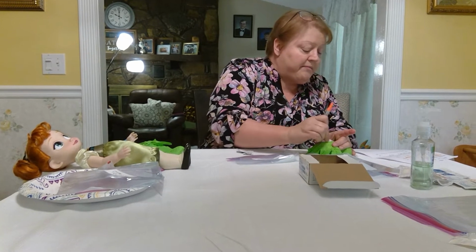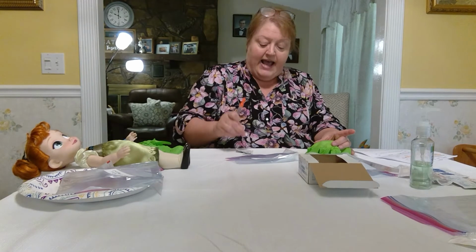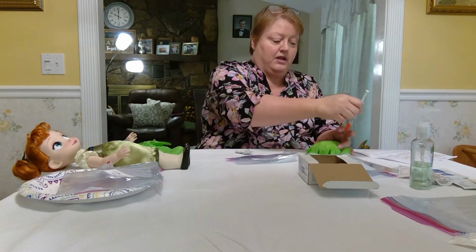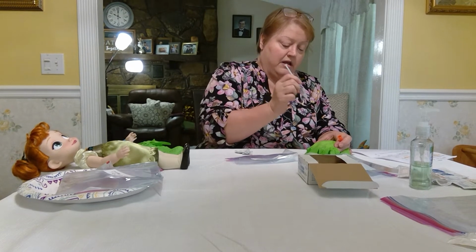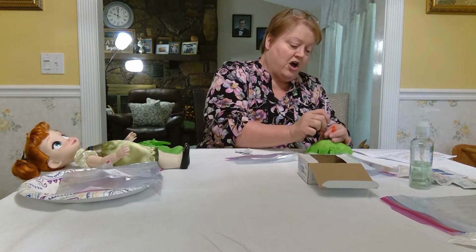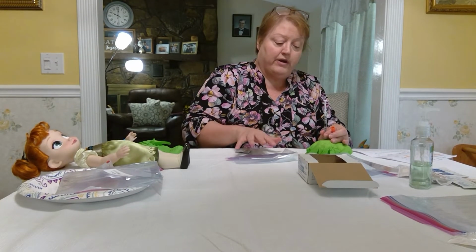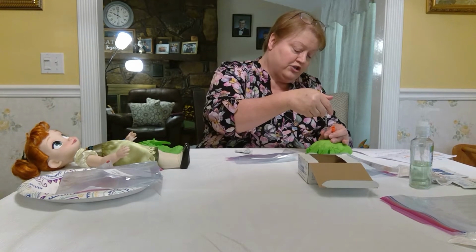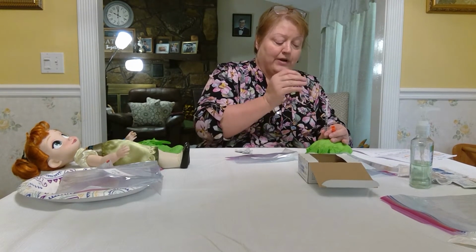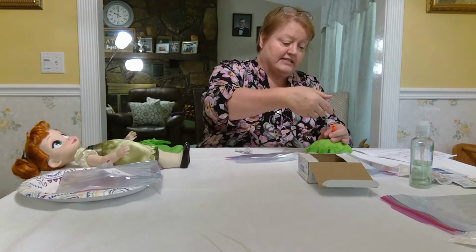And I'm seeing on my MAR that this is a 180-pound person. So with that, I know that I can go directly in at a 90-degree angle. I'm going to go in a dart-like fashion, inject, hold. I do not have to aspirate on anything that is sub-Q or intradermal. I'm going to support my syringe so that it's not going up and down or hurting the patient.